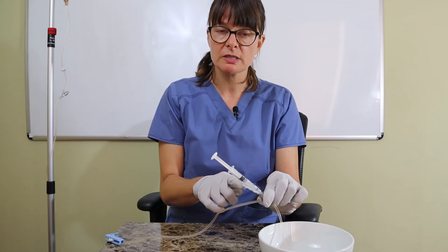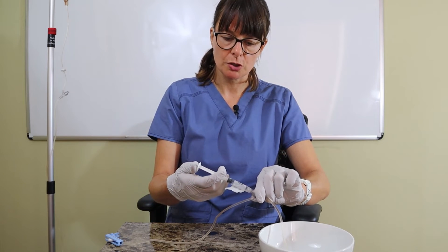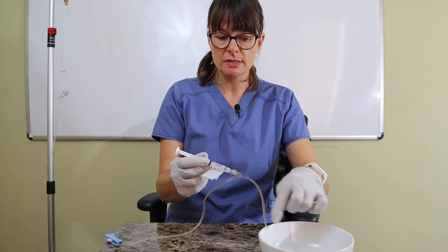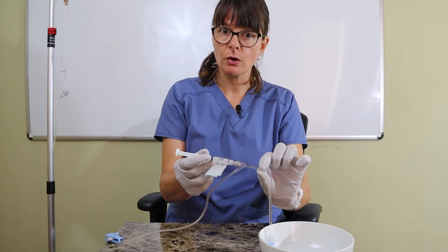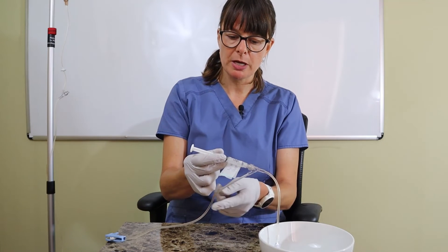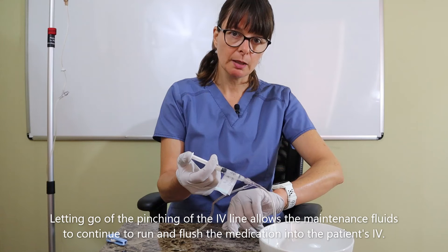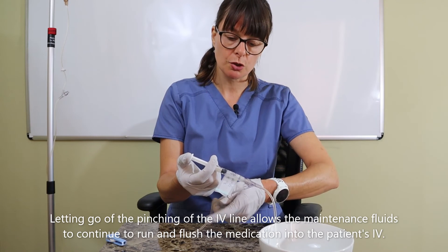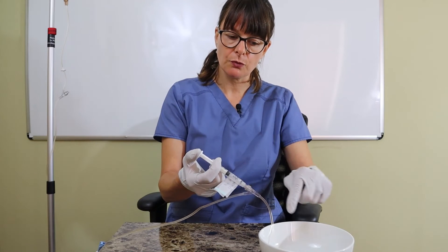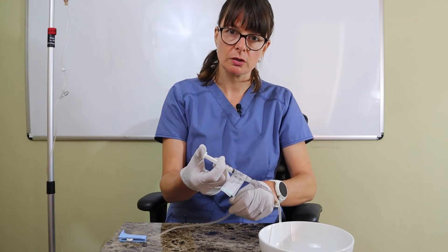Now I'm going to push this medication over two minutes. I look at my watch and slowly start to push. However, because of the path of least resistance, the patient's vein is narrower in diameter than this tubing, and I don't want the medication to go up the tubing — I want it to go towards the patient. So I pinch this tubing and slowly push the medication a little bit at a time, continuing to watch my watch — pinching it, pushing it — and the IV maintenance fluid as it flows into the patient's vein will carry this Zofran into the patient's circulation.